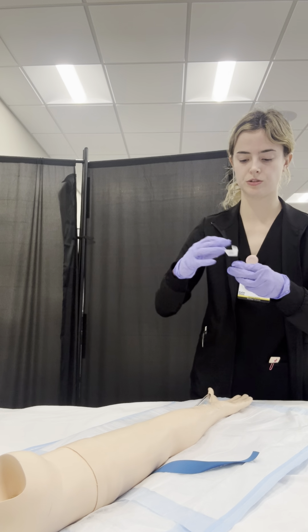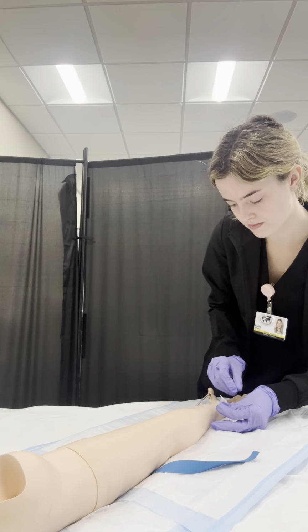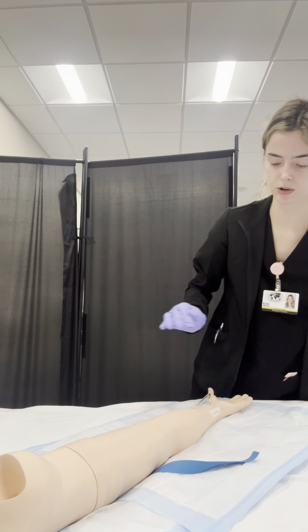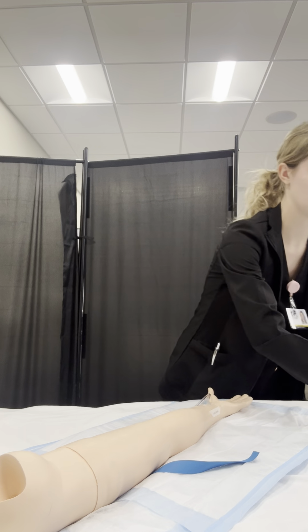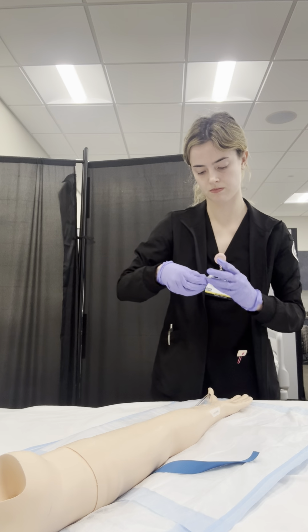And then I'm going to apply the label. And then I want to tape down the J-loop so that when the patient is moving, it's not moving with them.